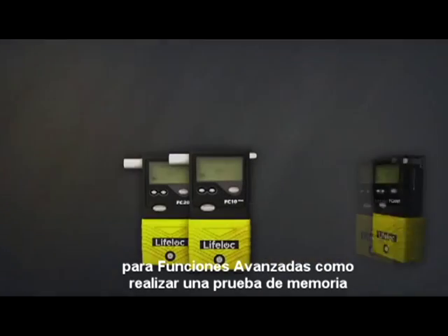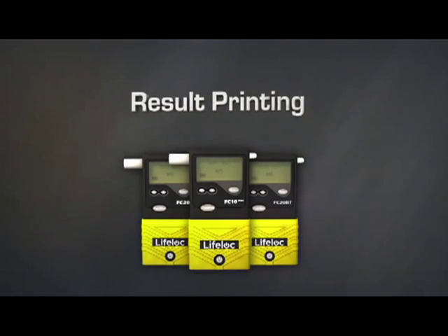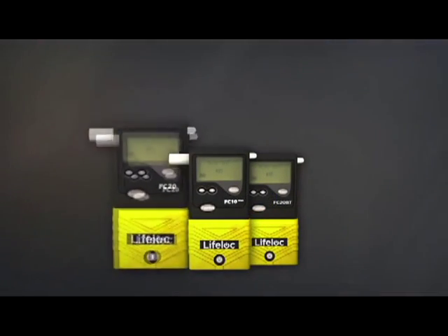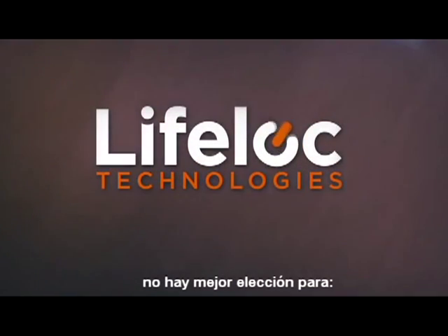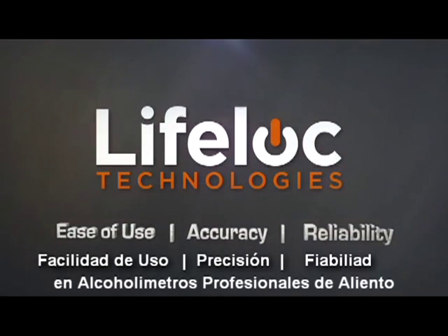For advanced features such as test memory, date and time stamping, result printing, computer interface, or Bluetooth connectivity, check out the FC 10 Plus and FC 20. There's no better choice for ease of use, accuracy, and reliability in professional breath alcohol testing than LifeLock.